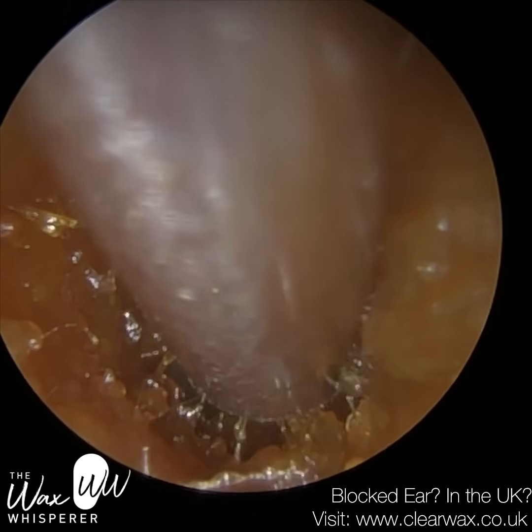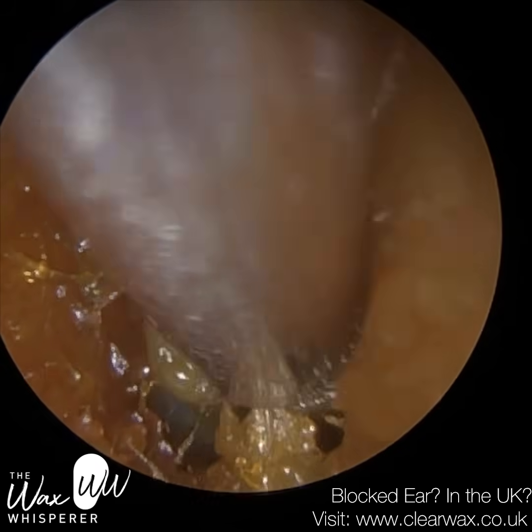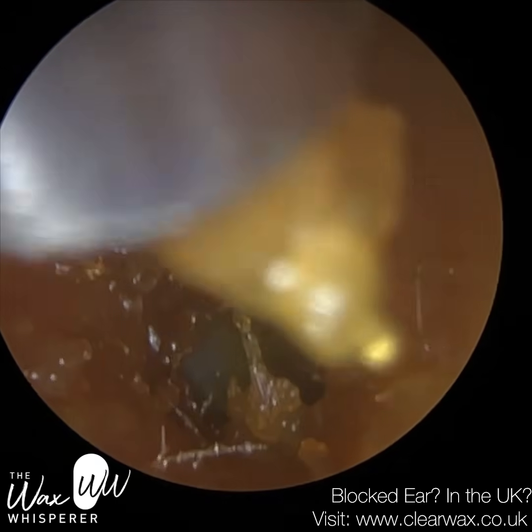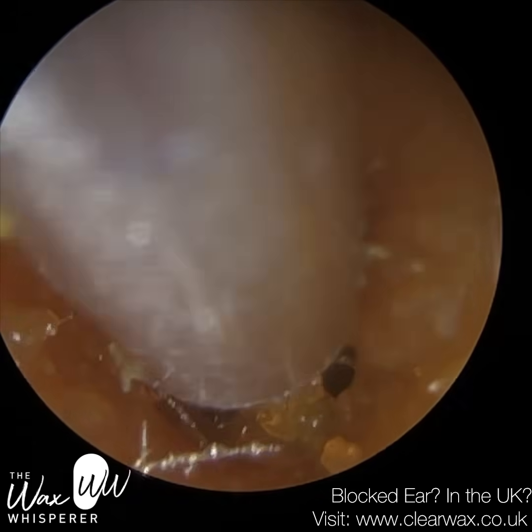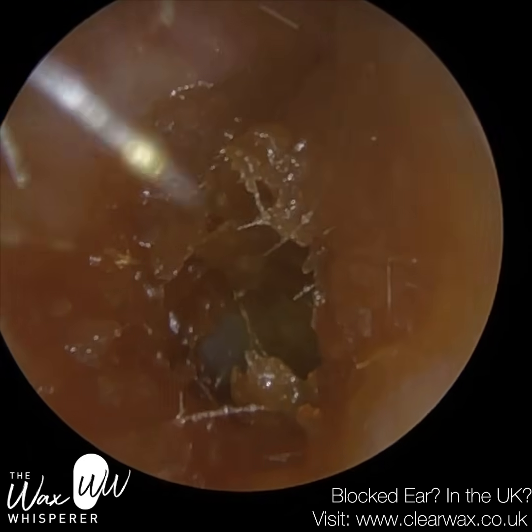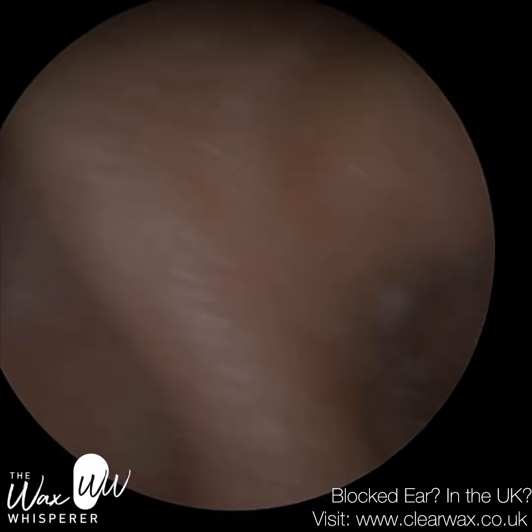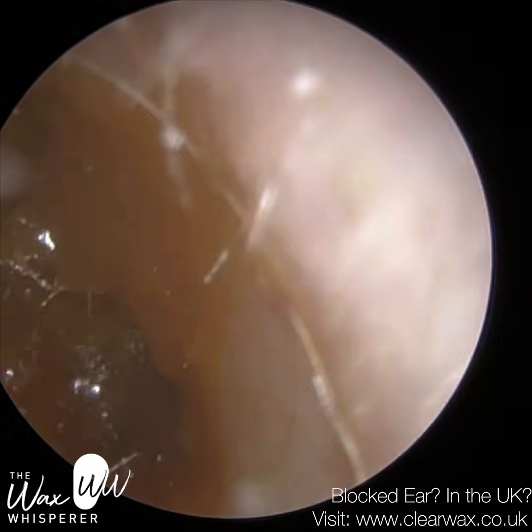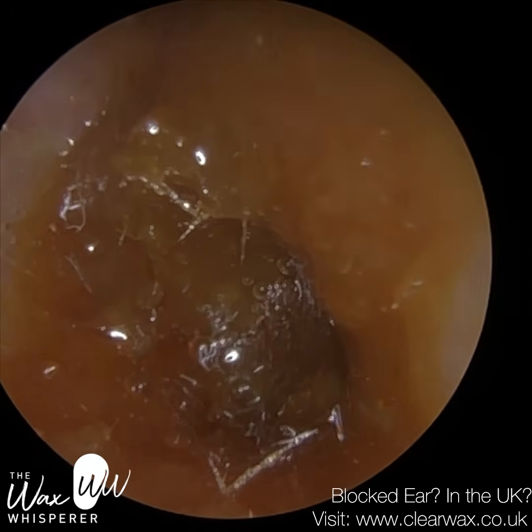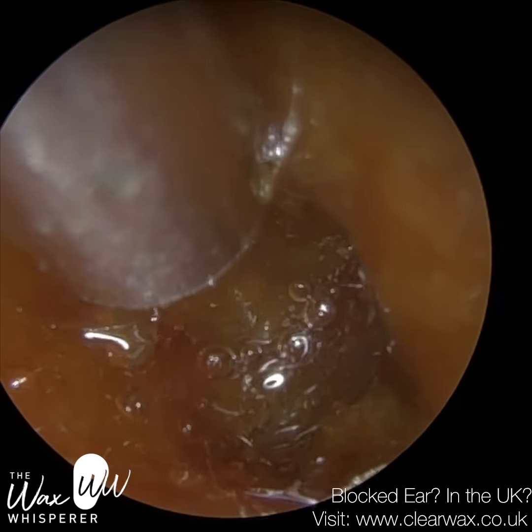Now you can just about see some of the eardrum about 7 o'clock, 8 o'clock, and the lower section now. So I did put some olive oil spray just to help to change the consistency of this wax. So whenever you're using drops, the way I recommend to use drops is 2 to 3 times a day. Fill up the ear, so you can be a bit generous.